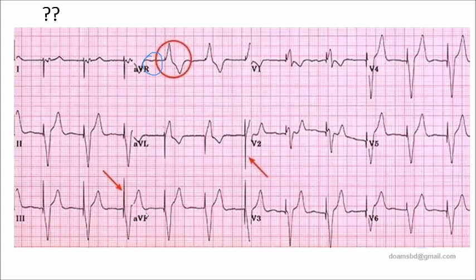This is the QRS complex. Before the QRS complex means some stimulus is going to the ventricle. Now which ventricle, left or right? If the R wave is high, that means right side activity is more. So some stimulus is happening in the right ventricle.